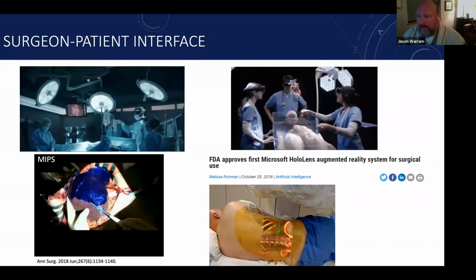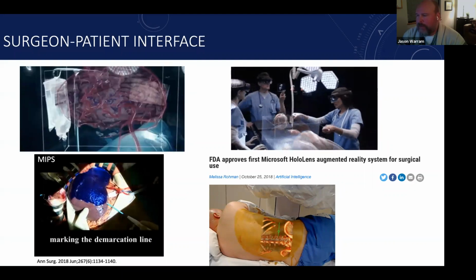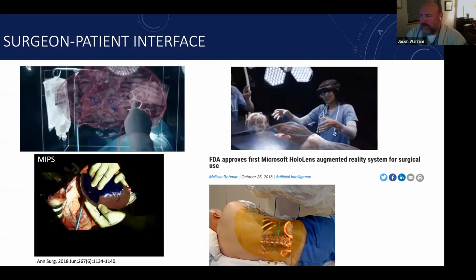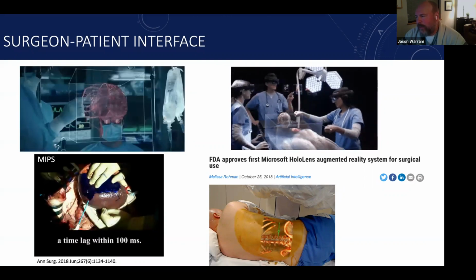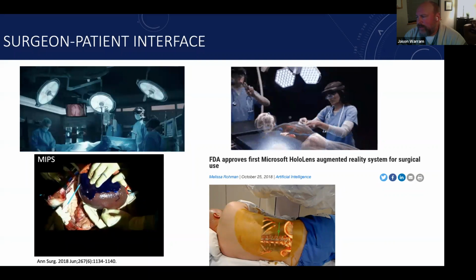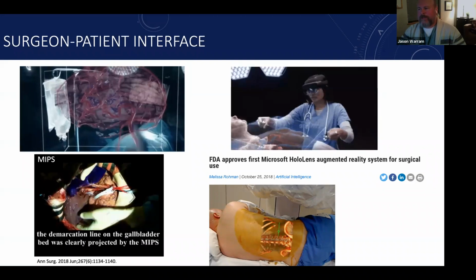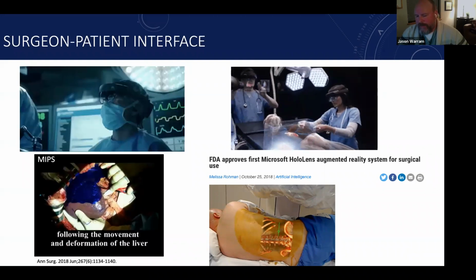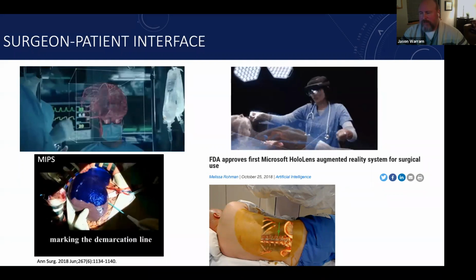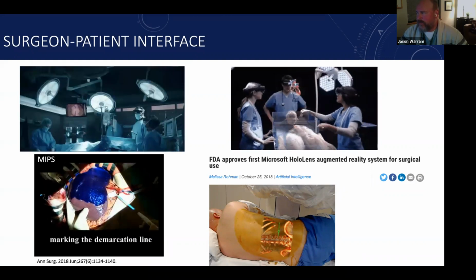Additionally, there are other people that are ahead of this. I know Sam Achilefu, previously at WashU, I forget where he is now, has been working on this technology. There's the medical imaging projection system, a group in Kyoto, Japan, using ICG emission signal and active projection mapping in hepatectomy procedures. This is more for the device crowd. How are we going to provide the information to the surgeon seamlessly, in a way that doesn't interrupt the surgery, is not invasive, and is not bulky? This is a big question for device manufacturers moving forward.